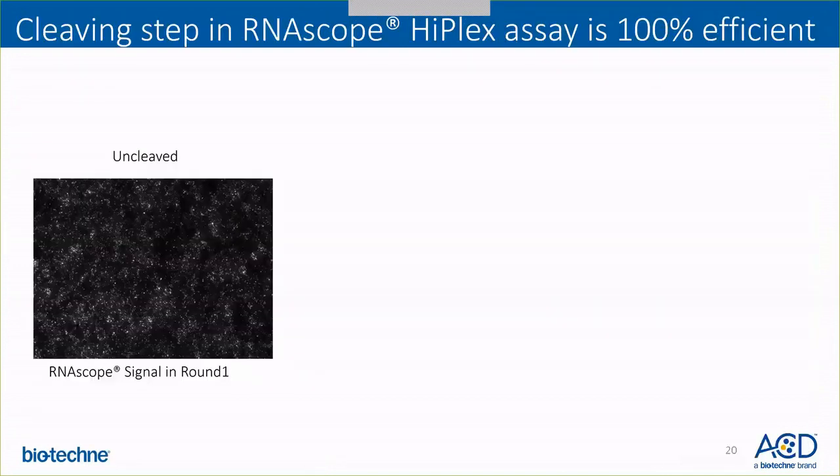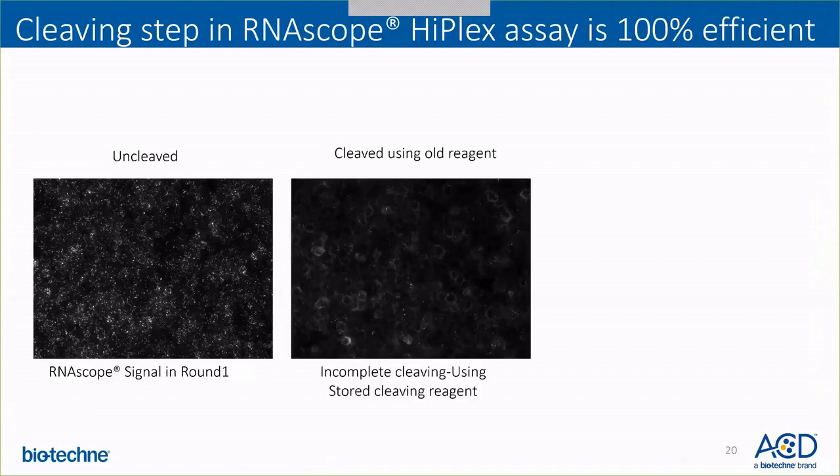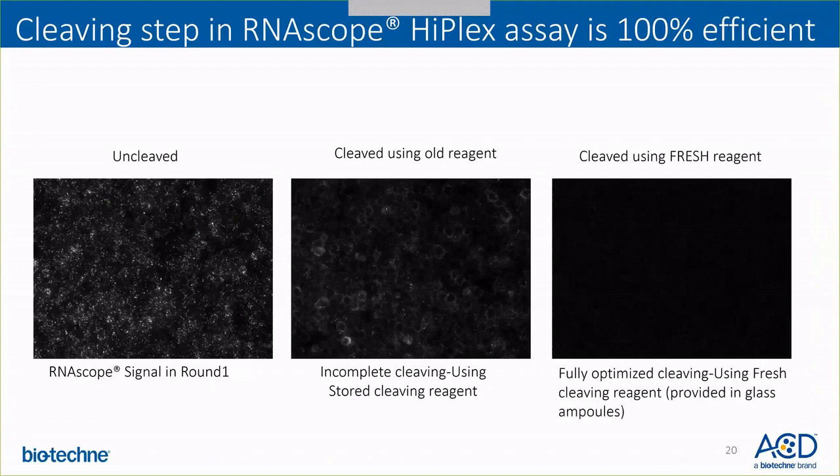Another question is: how efficient is the cleaving step of the RNAscope HyPlex assay? The cleaving step is 100% efficient when optimized. As you can see here, the panel shows the signal of the RNAscope HyPlex assay — when you don't cleave it you see some dots, and if cleaving is not optimized you may see fainter dots. But if the cleaving is completely optimized using the fresh cleaving reagent that comes with the RNAscope HyPlex assay, you can see 100% cleaving. Please make sure you are using the fresh cleaving reagent out of the glass ampoule and not a stored cleaving reagent.